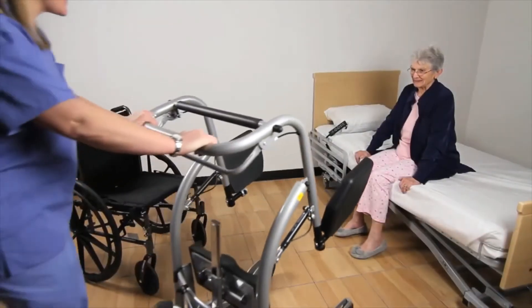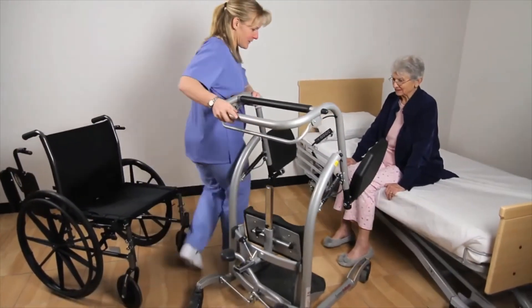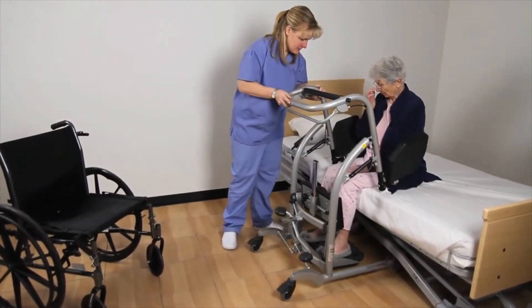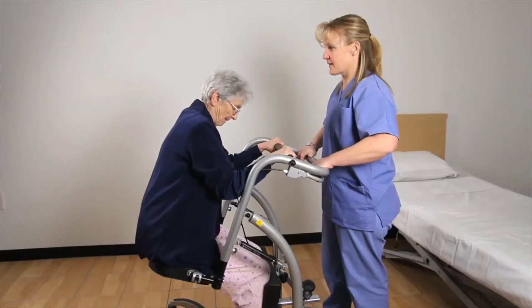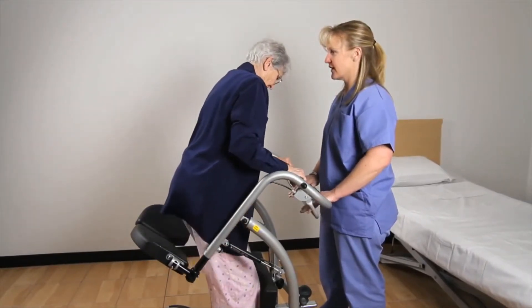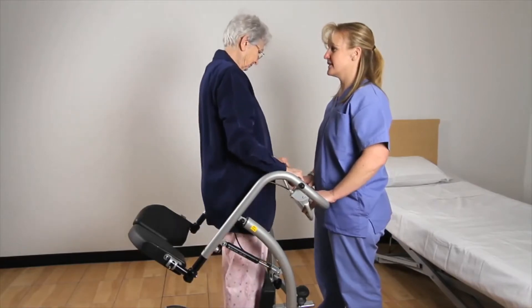The Quick Move is a uniquely designed non-powered stand aid used for transfers with patients that are able to stand and bear weight but may have impaired balance or weak leg strength. It is important for the patient to have upper body and arm strength to assist in pulling themselves to a standing position.